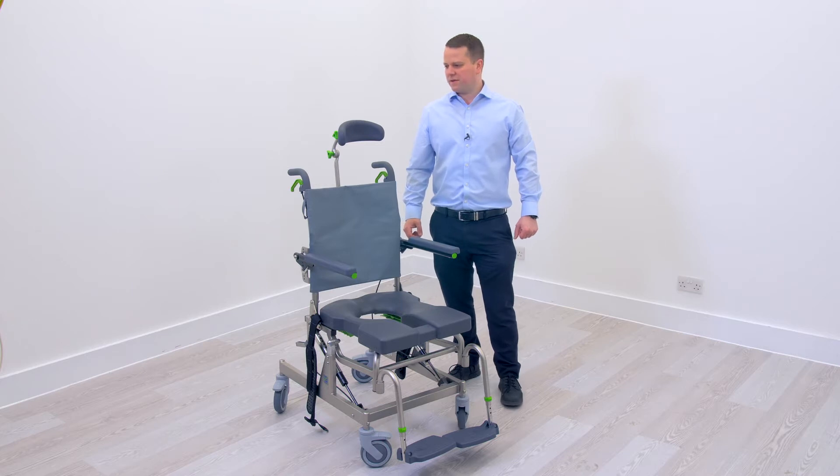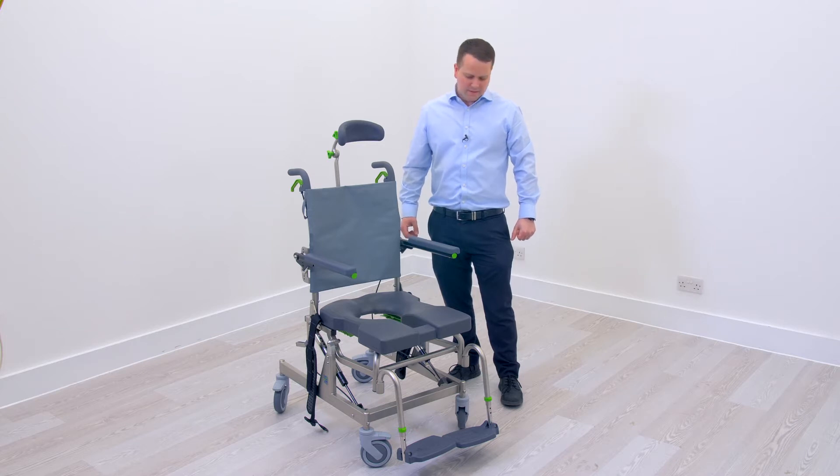The purpose of this video is to help you set the RAZ chair up for yourself or someone you may have prescribed the chair to. These small adjustments will make the chair a lot more suitable for the user, and having the correct height and support will make a big difference.